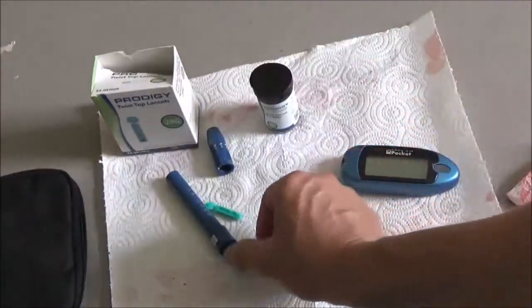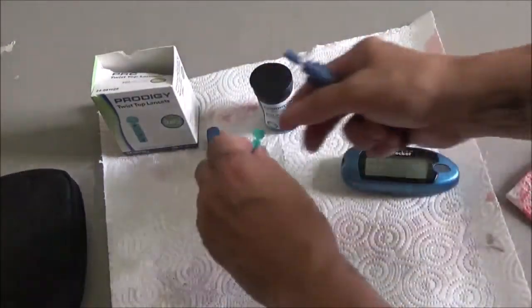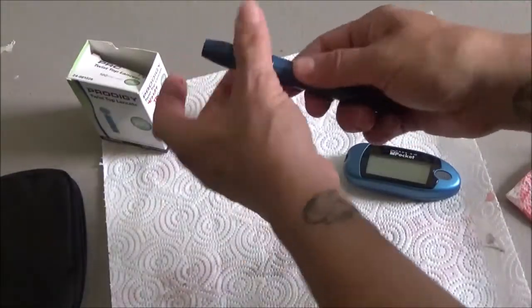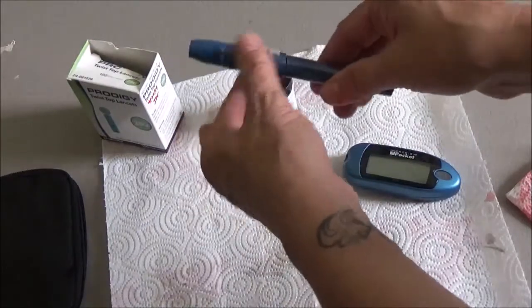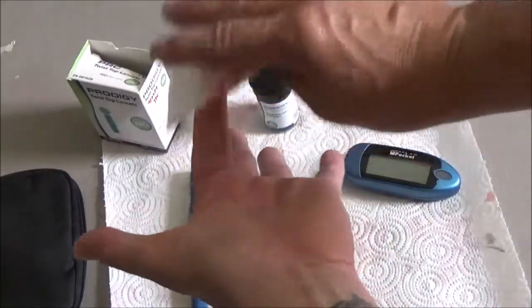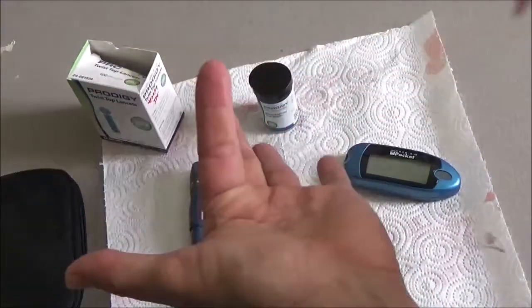All right, so what I'm going to do is I'm going to load my lancet with a sterile needle. There we go. I'm going to put the cap back on. Okay, I'm going to cock it just like a shotgun. It is ready to go. I am going to clean my finger with a sterile, well, it's not sterile, but it's basically an alcohol swab to clean the surface of the skin.